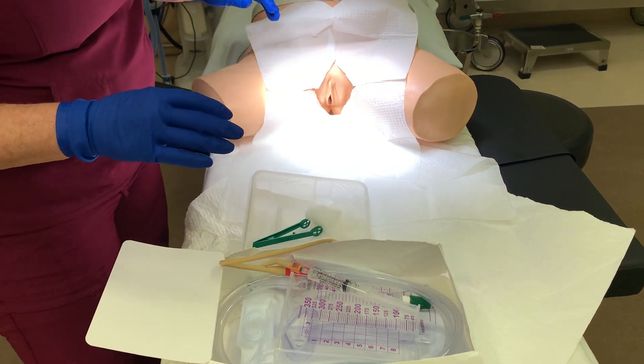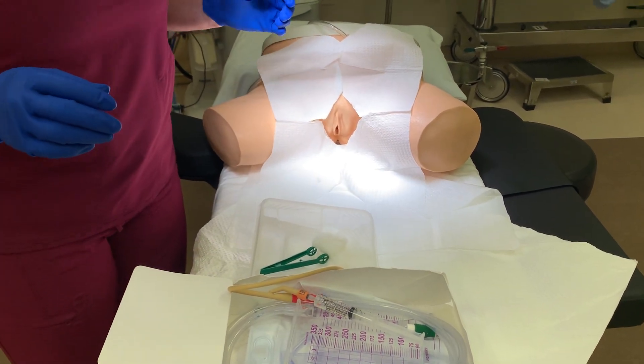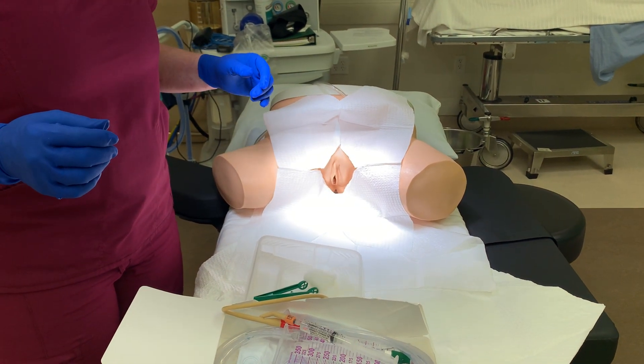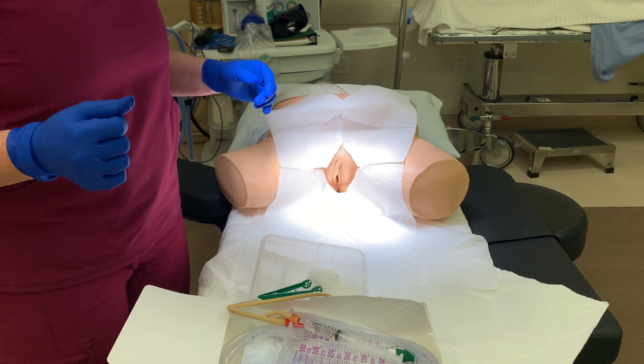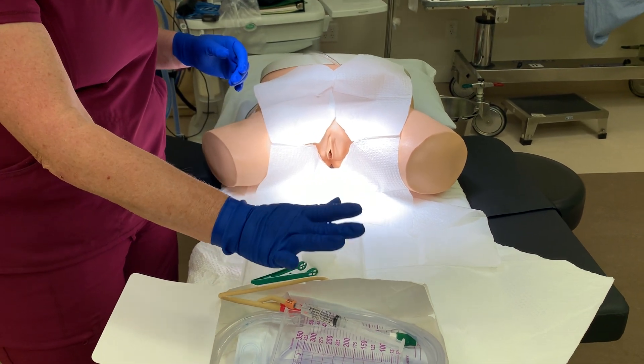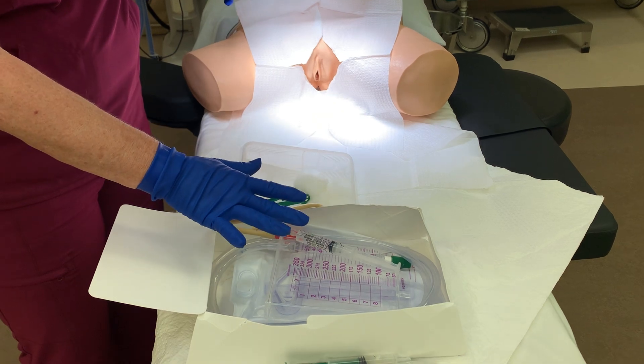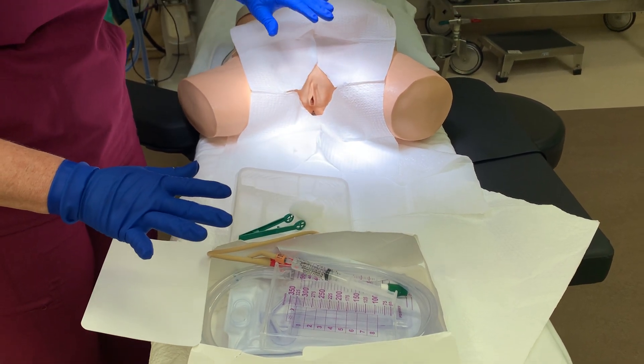The next thing you need to know is that you always want to retract the anatomy with your non-dominant hand. So I am right-handed, which means I'm going to be using my right hand to work with all of the components. I'm going to use my left hand to retract.